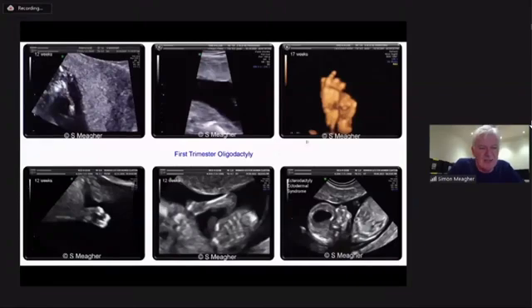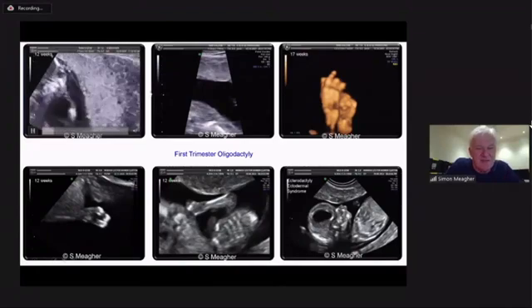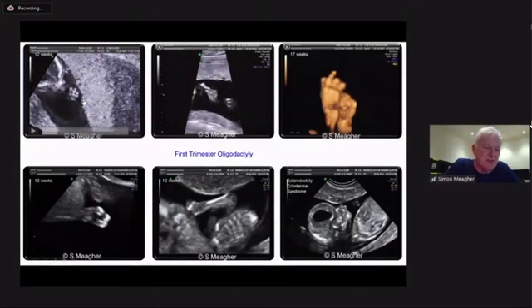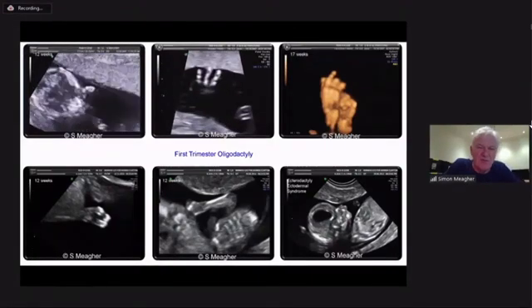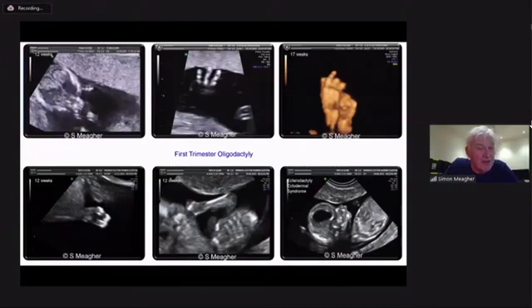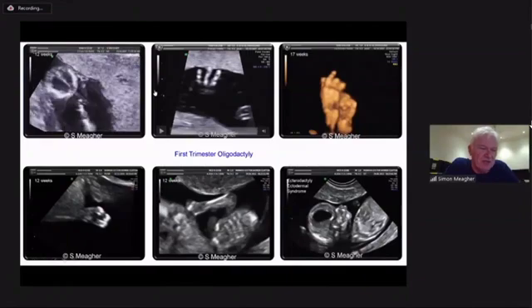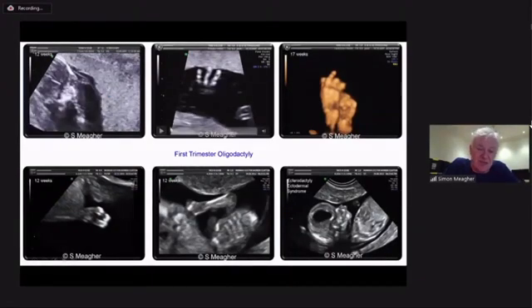There's then oligodactyly. When you're looking at oligodactyly here, you can see this fetus with 3 fingers and a thumb. This is more footage of the same patient at the mid-trimester, showing the thumb and then coming across 3 fingers. And this is the rendered image of the same fetus. Sahara mentioned to me as we were just preparing before we started the seminars, in a scenario like this, where you see a fetus, particularly in the second trimester, who's growth restricted, to remember to consider Cornelia de Lange in these situations where you have oligodactyly.